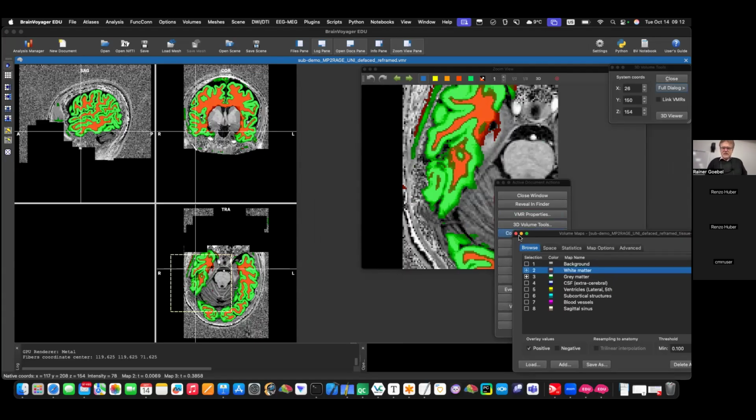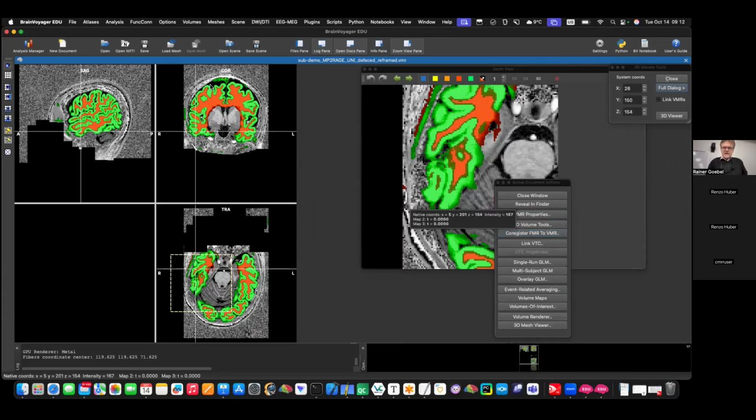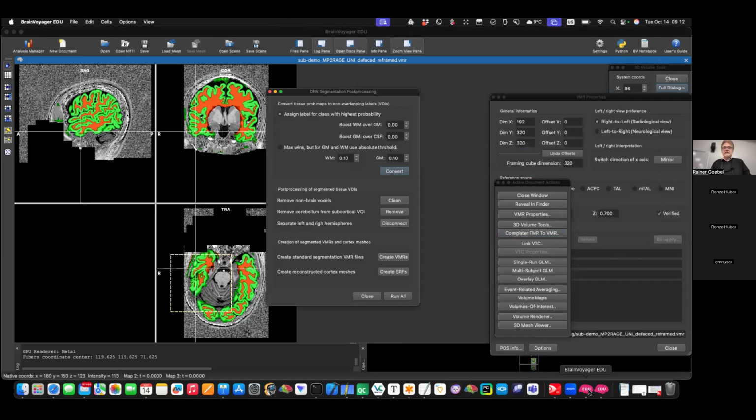I would now come to your question, Federico, because what we now do is we open the dialog which automatically opens the tool when it's finished. You see, I have now two EDUs here. I go to the one which calculates. It's done already. You see, it came up. This is now the EDU version which I ran before, and you see it's the same segmentation we got, but it opens already this dialog here, which is the next post-processing.